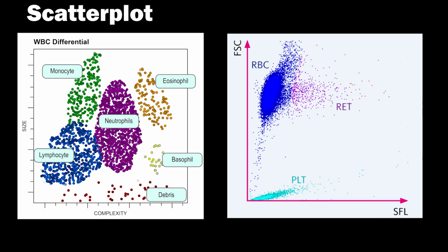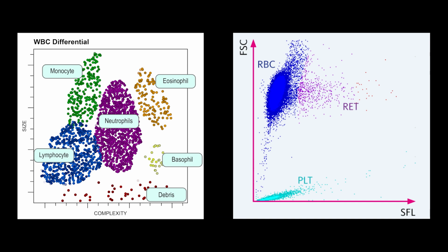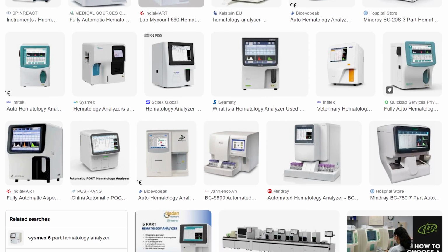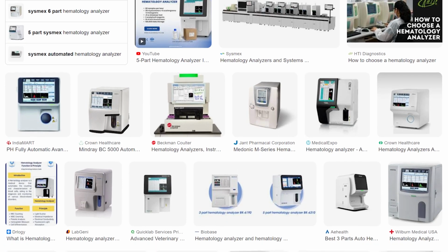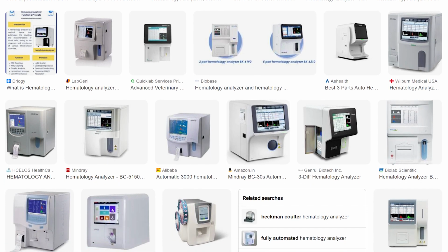This same process of white blood cell identification is also used to identify reticulocytes. Different reagents are used, which will stain the residual RNA in the red blood cells and can then be detected using the same laser light in the flow cell. This analysis is only completed if a doctor has ordered it in the test profile. Each analyzer manufacturer will have unique reagents and analysis techniques and algorithms to identify white blood cells and reticulocytes. The principles of electrical impedance and radiofrequency to determine the white blood cell count and size may also be applied at this stage and is not shown in the video.